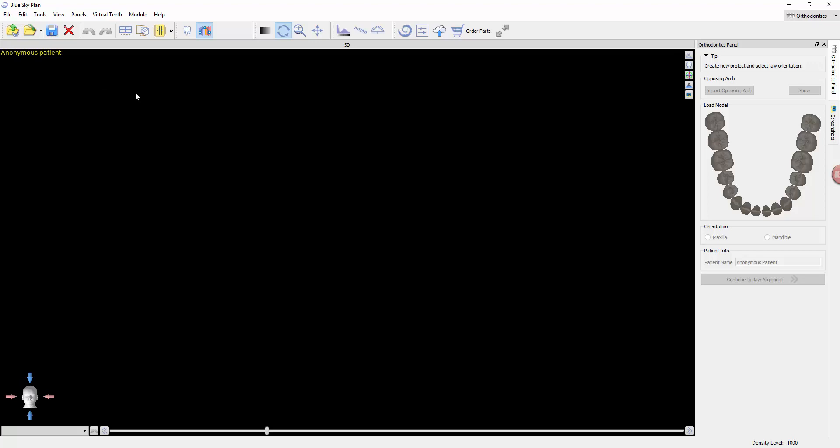Okay, so in the actual software to get us going, the first thing we're going to do is open up a case. In this case, I'm going to show you a sample case of treatment plan in the upper arch. So I'm going to click right here, which is new project.